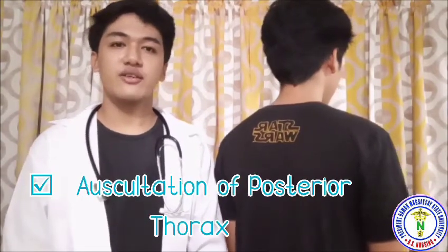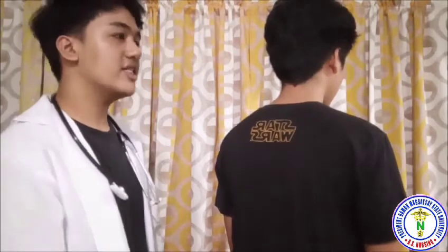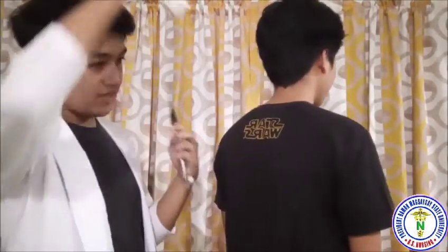Now, let's proceed to the auscultation of the posterior thorax. Sir, can you please take a slow deep breath using your mouth as I auscultate your back?